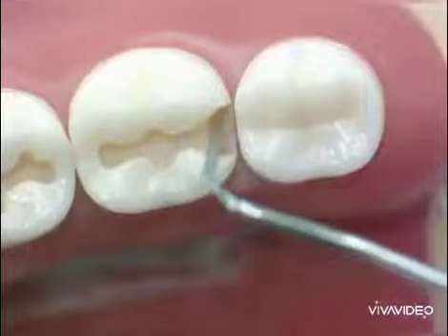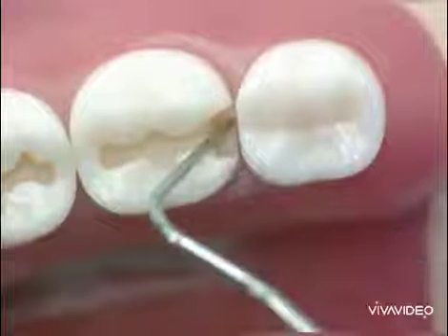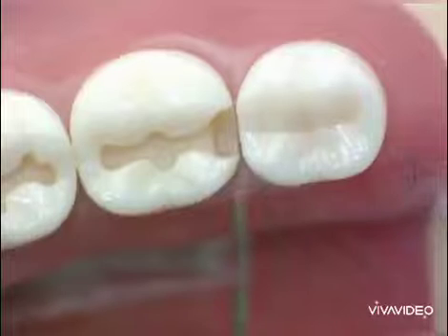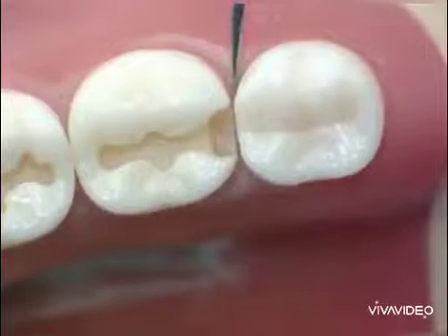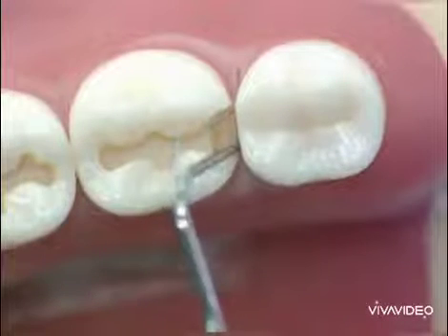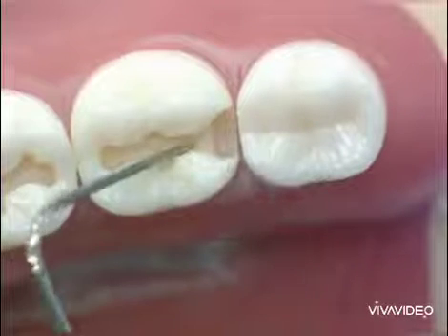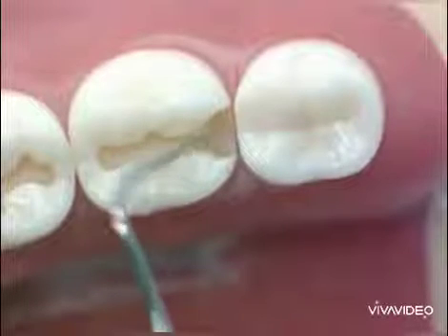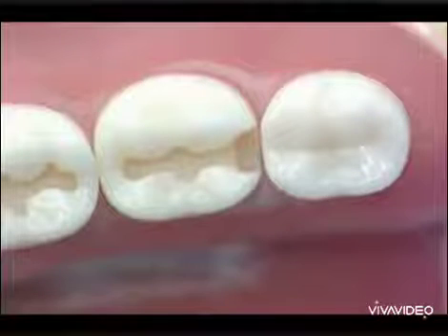Check the cavity with a probe — it should be smooth and flat. A 0.3 mm separation should be allowed between the gingival cervical surface and the proximal surface of the adjacent tooth. This means that only the tip of the probe can pass freely between the two adjacent teeth. All internal line angles should be rounded.